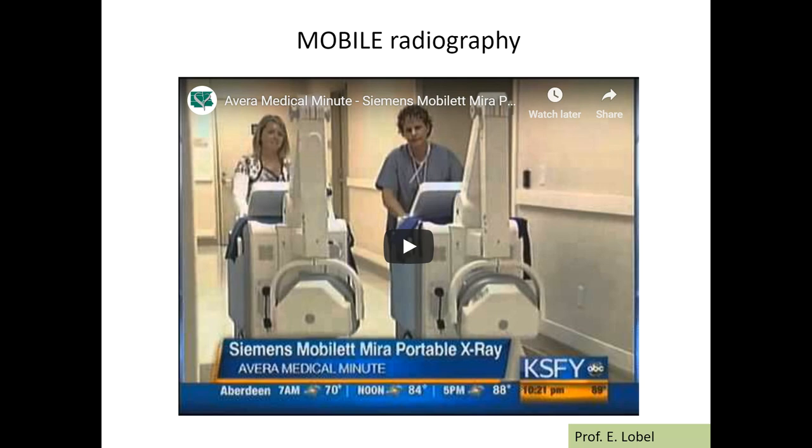I don't know if you noticed in the video that when they are angling, they actually have a degree of angle readout on their tubes, whereas the GE doesn't. You just kind of have to guess. I mean, it'll kind of stop at 90, but if you wanted like 48, you'd have to, you know, guess for the most part.